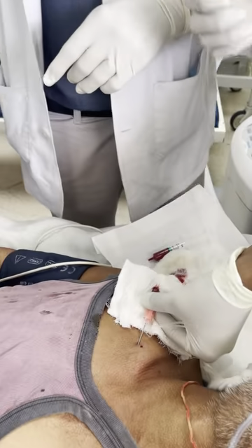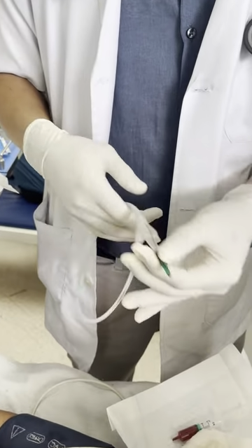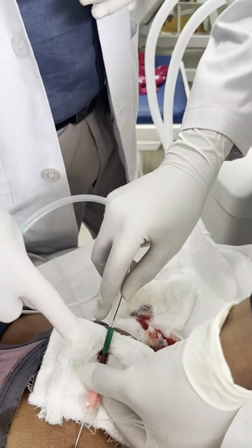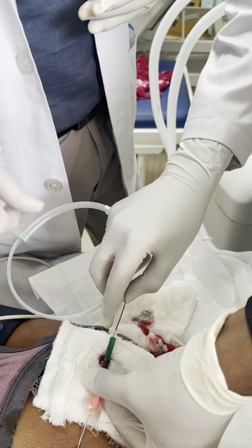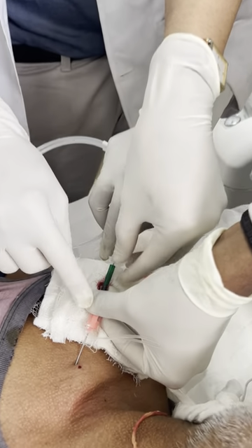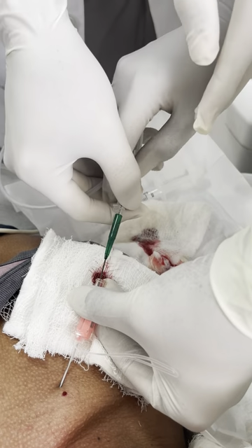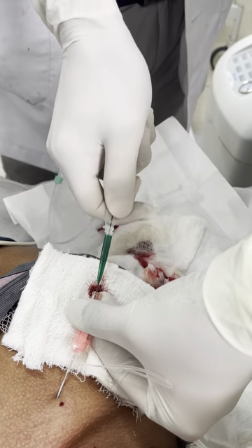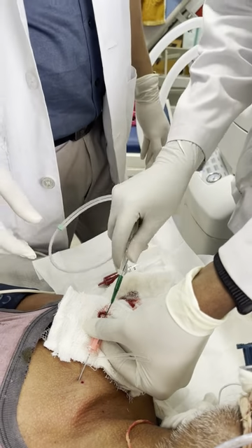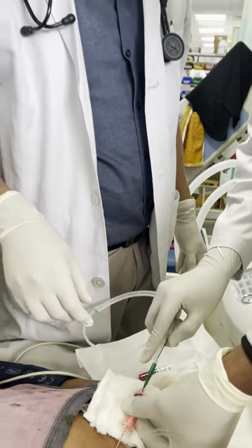Now this is called the guide wire. First see that the motion is very smooth. Keep your whole concentration on this, nowhere else. Go. Slide it inside. Once it has gone this much, you can come out and you can go like this. I tell you, leave it. This is a faster method. Do it by your own hands. Do it. Don't fear. Go.